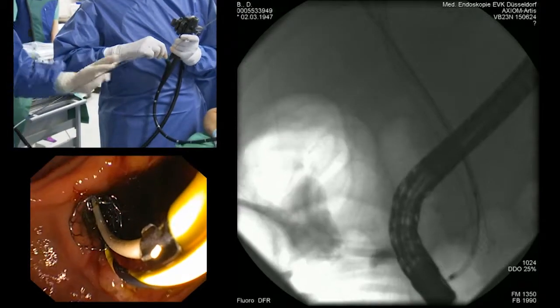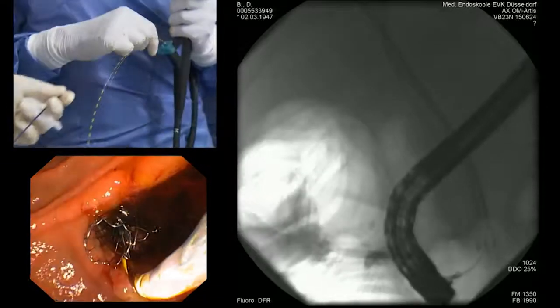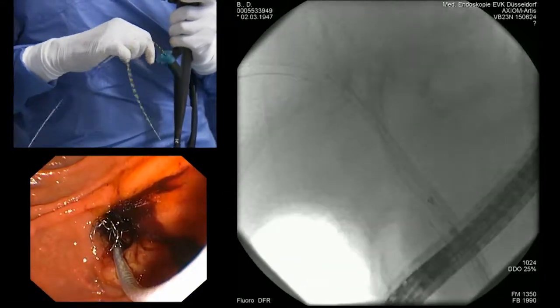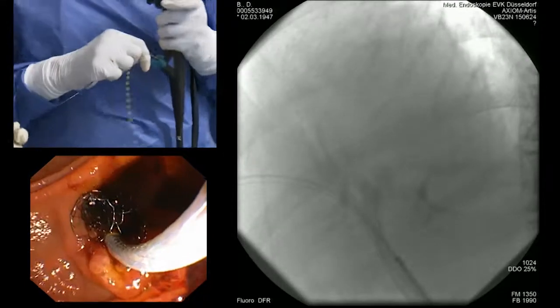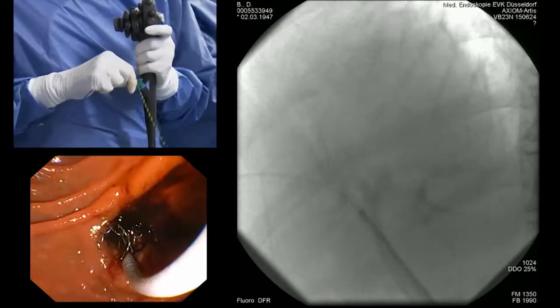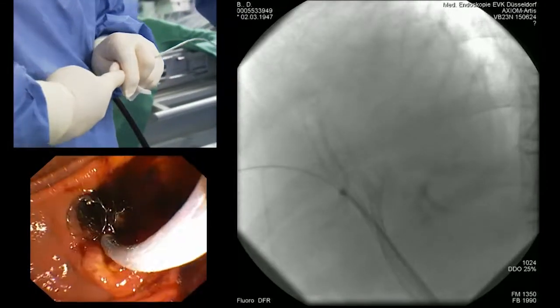Now I am going to take out the stent along with the guide wire, as we don't need the guide wire anymore. This is going to be the challenging part — the third stent. You can see it is going up now. I am going in and as it goes in I am trying to feel for it — this is where the resistance is. I am going to use a little screwing movement, a jiggling movement to get it in. Ralph is pulling on the stent, which is why it is going inside; otherwise it would have been extremely difficult.